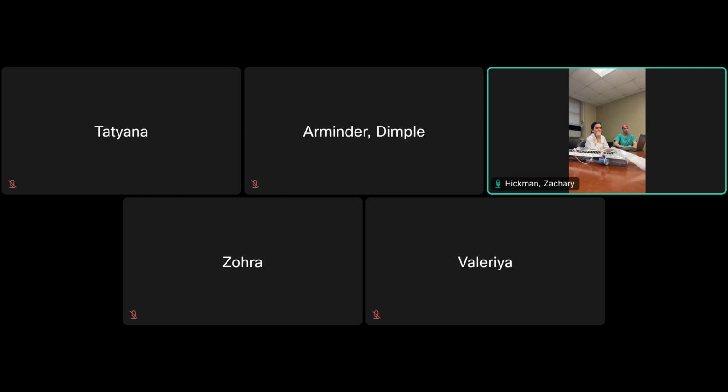But generally speaking, most places in the skull, if you aim perpendicular to the skull, if you're at a point where you can hit the ventricle, then if you're perpendicular to the surface of the skull, you'll hit the ventricle. So what are some other entry points?